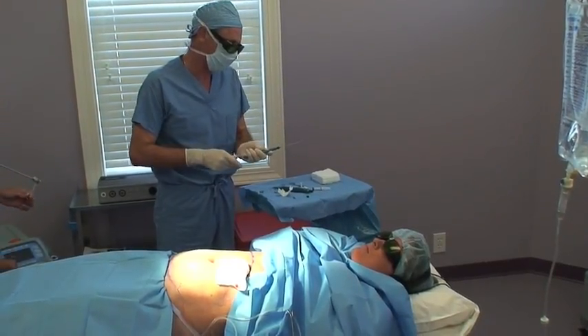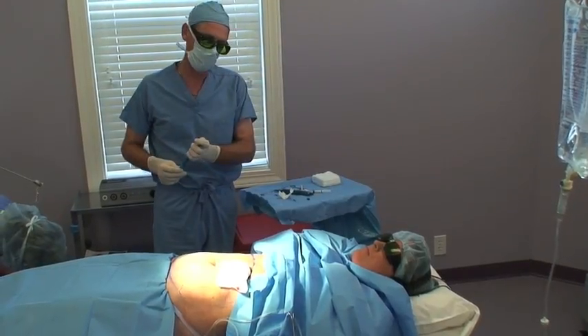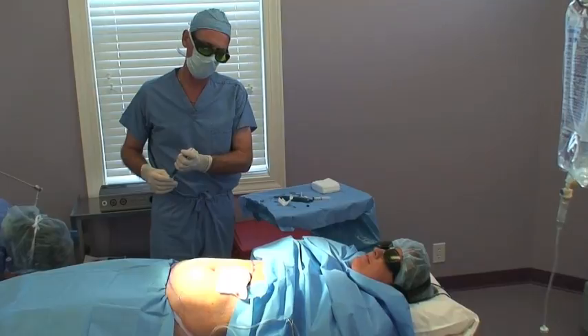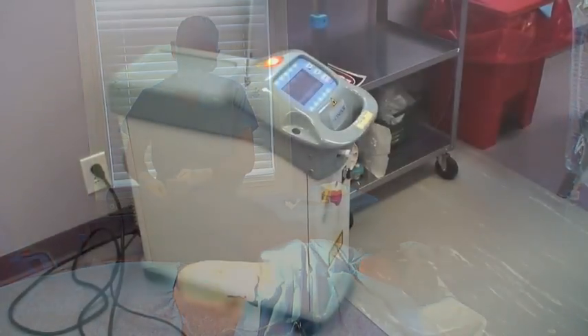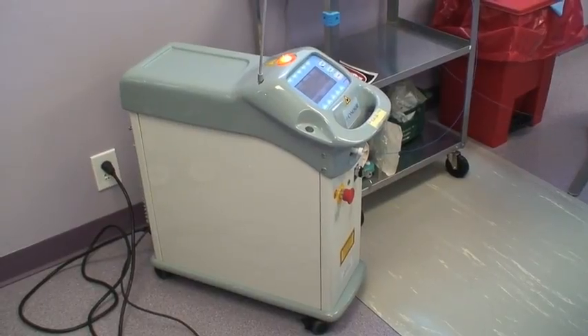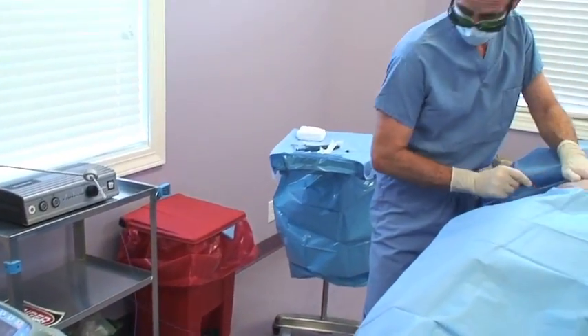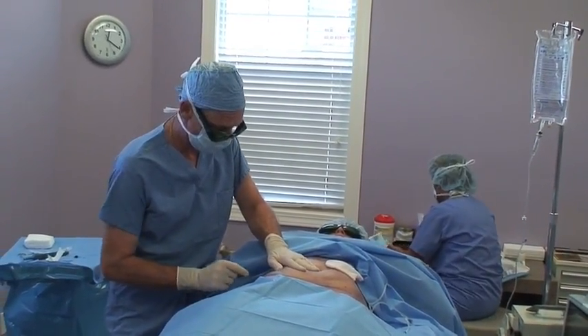The second stage is actually the laser lipolysis, or laser treatment. I use a SmartLipo laser. This does a couple of things for us. First of all, it tends to partially liquefy and soften up the tissue, making it easier to suction. Secondly, it heats the tissue and this helps shrink it, particularly in areas where the skin tends to be a little lax or may not contract as well as you'd like.